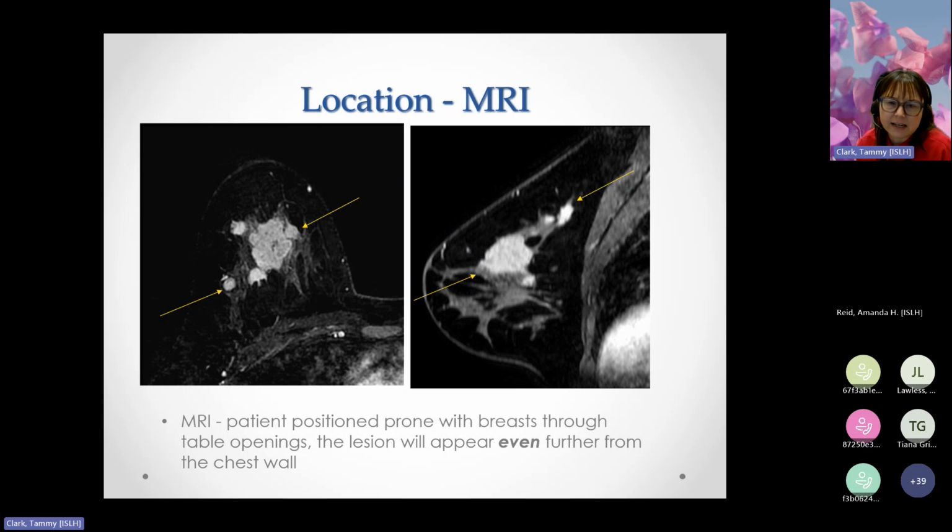the central breast that extends medially, laterally, and superiorly with 3 smaller satellites. So 1, 2, 3. This is probably all together, and these are the satellites here. The maximal diameter is 8.5 centimeters. So she's got, it's not multifocal, it's multicentric because it's definitely taking up more quadrants.